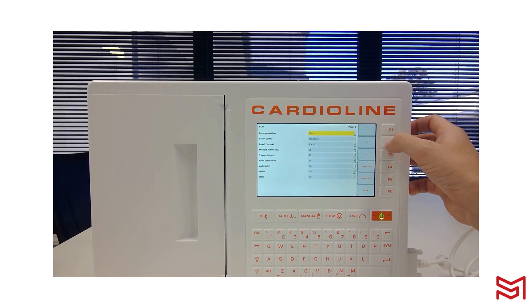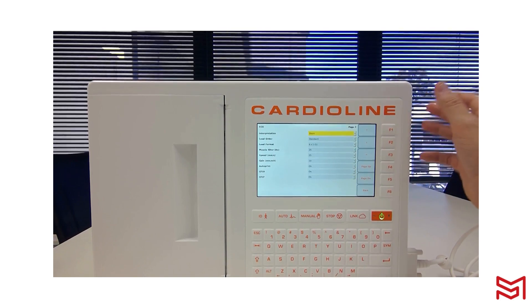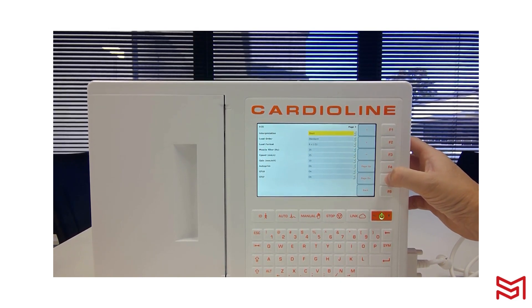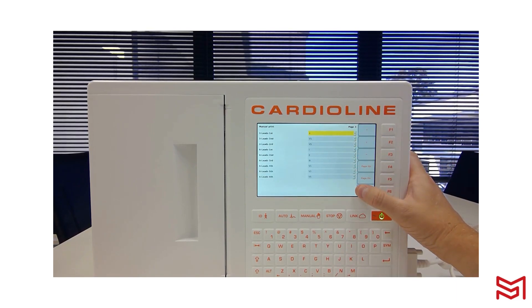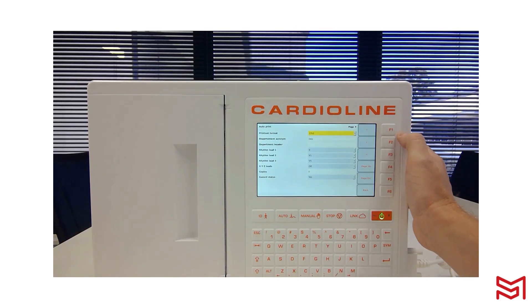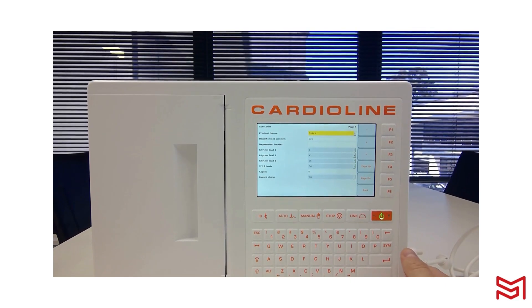For interpretation, you can keep it short, change it to long, or turn it off — I recommend keeping it short. Moving to page 4, for the printout format I'm going to change this to 3 by 4 by 1, which gives me 3 lots of 4 two-and-a-half-second segments plus a rhythm lead at the bottom. Save that setting.